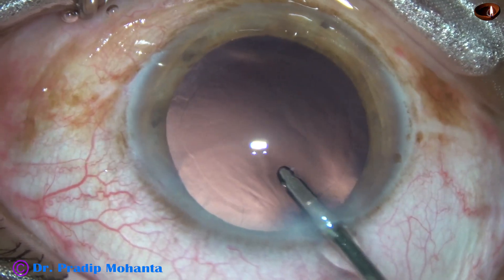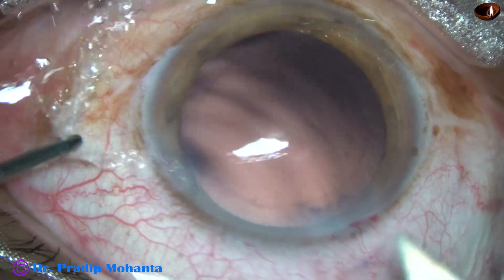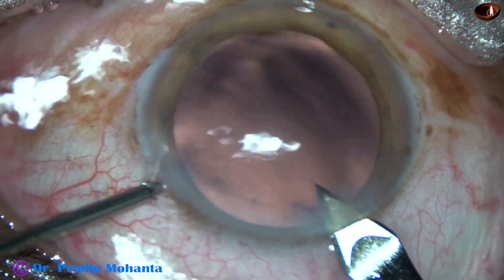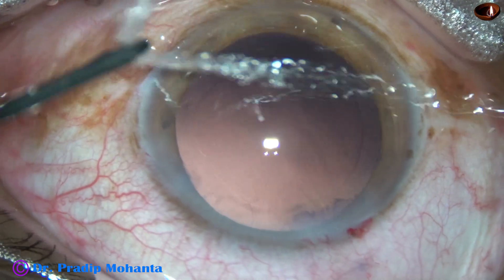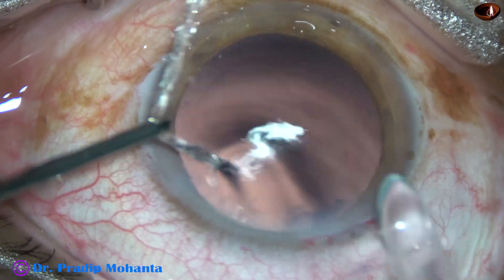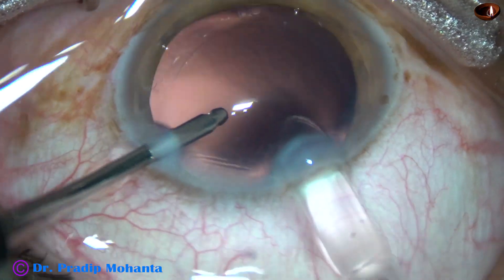And since I am going to use a B cartridge, I am going to enlarge the main wound a little bit. And here goes the hydropolish.